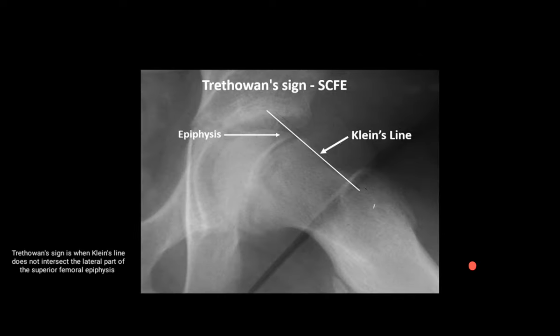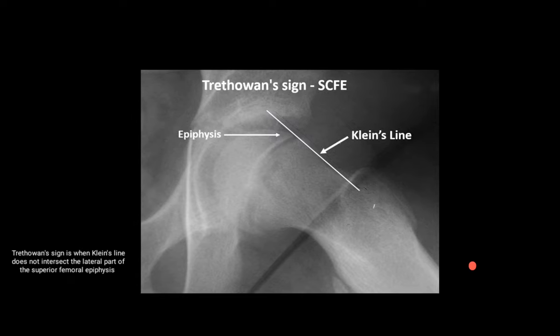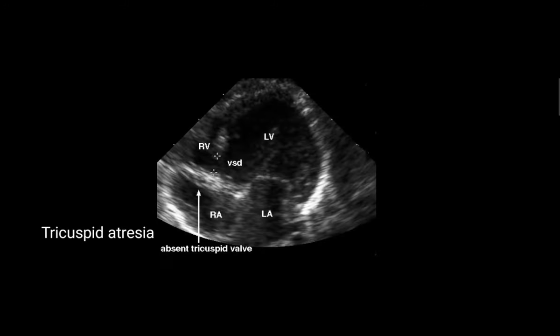The next image is of SCFE — slipped capital femoral epiphysis. It is an orthopedic condition and the classic sign seen in it is Trethowan's sign. In Trethowan's sign, Klein's line does not intersect the lateral part of the superior femoral epiphysis.